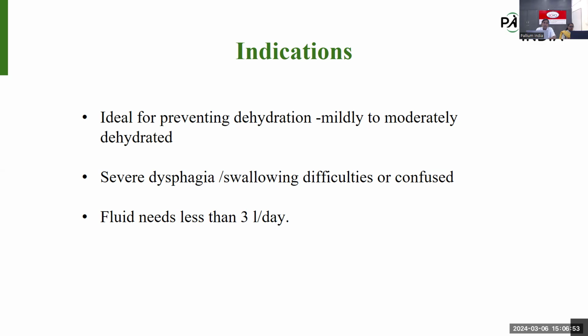If the patient is having severe dysphagia, that is swallowing difficulties, or if the patient is confused, in that situation also we can choose subcutaneous infusion. And we already said we are talking about a smaller volume. If the fluid need is less than 3 liters per day, then we can choose subcutaneous infusion for that patient. These are the common indications for subcutaneous infusion.